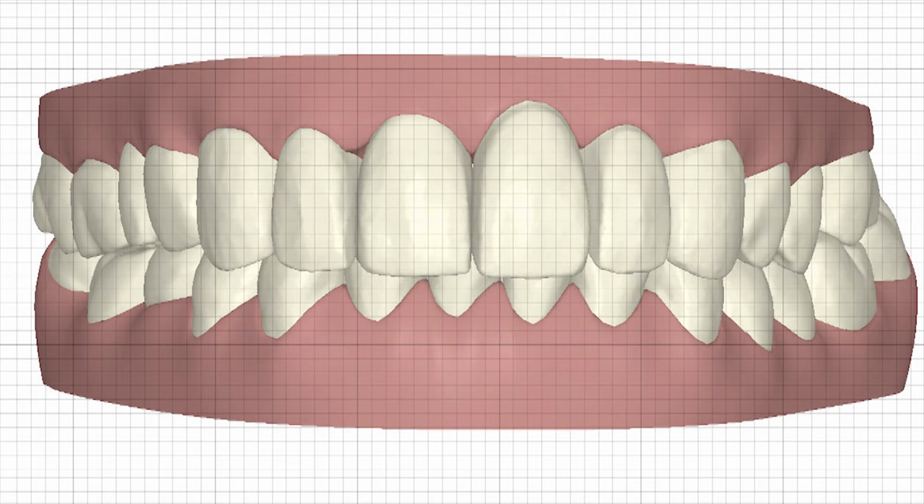There were several objectives to the orthodontic treatment plan for the mandibular anterior dentition. The lower canines and incisors exhibited significant attrition, likely due to occlusal forces. Over time, as the incisal edges were worn, the anterior teeth had extruded such that the vertical appearance of overbite deepened to 60 to 75%.